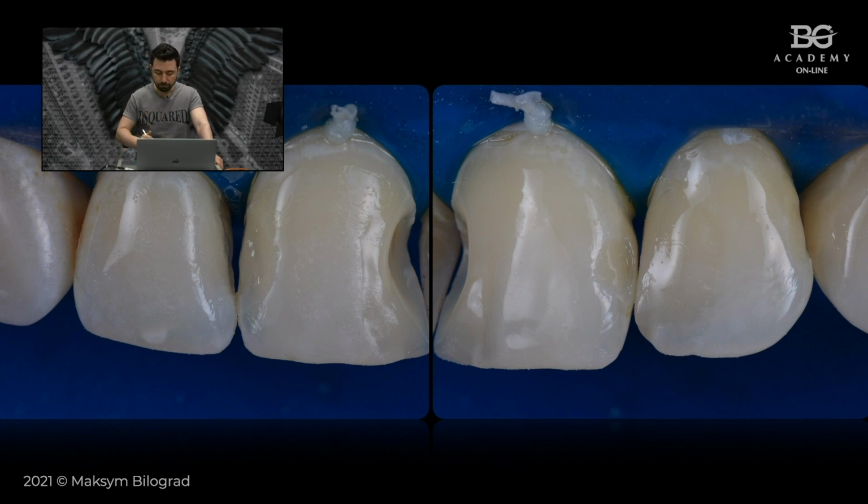So you have to apply a very thin portion of dentin over the beginning of the chamfer. Okay, got it? So we have the chamfer, which is here, or bevel. We have the bevel. This is our bevel all the way around.